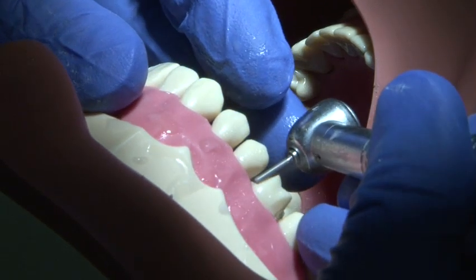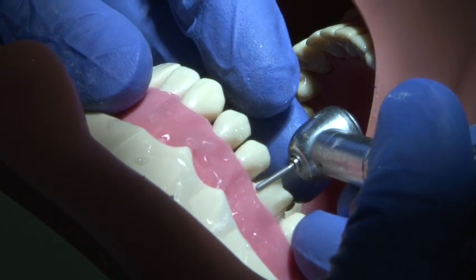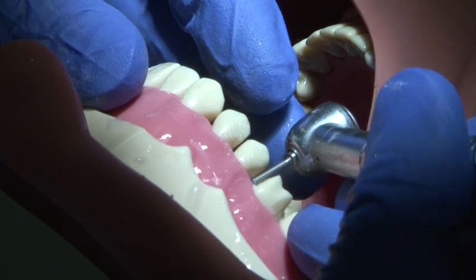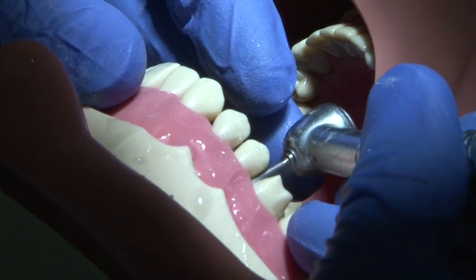After interproximal reduction, the margin is prepared using a parallel sided round ended medium grit burr. A smooth action is used supporting the burr hand.